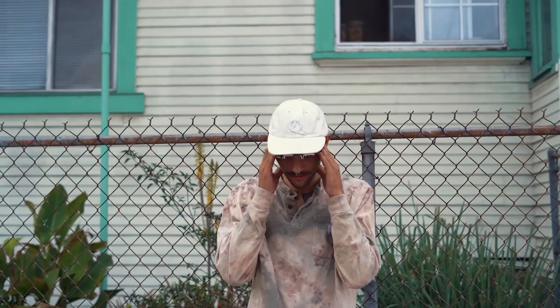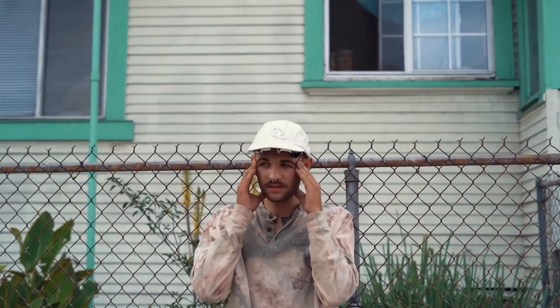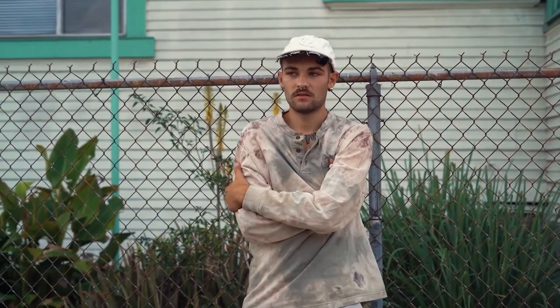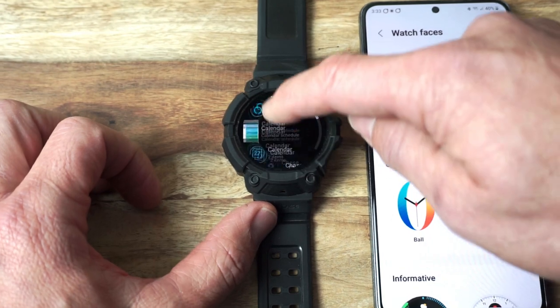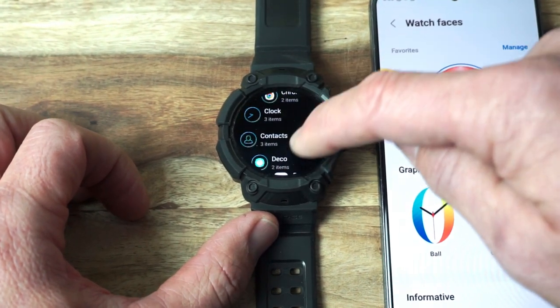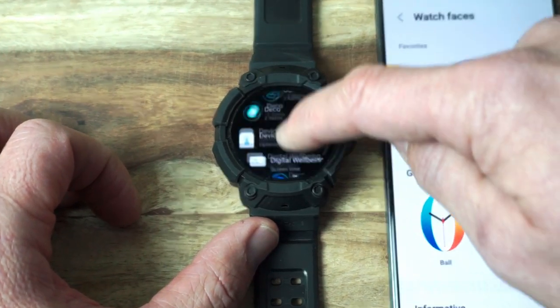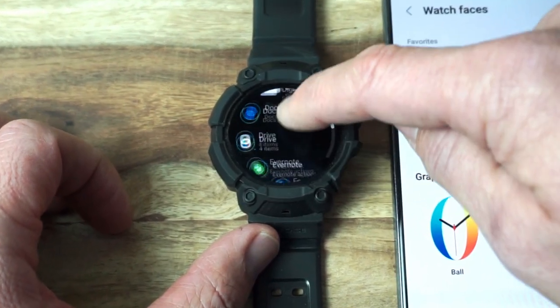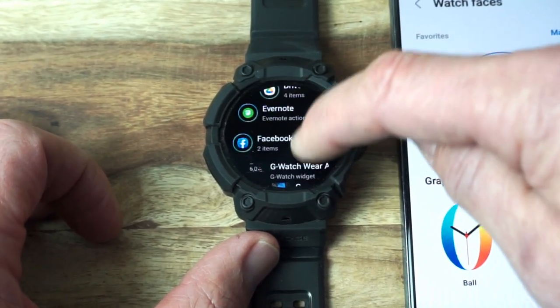So what is a complication and why does it have the worst name ever? Honestly, who would ever want anything in their life called complicated? I know I wouldn't, but you should. Today, I'm going to show you how to add a CGM complication to a watch face.